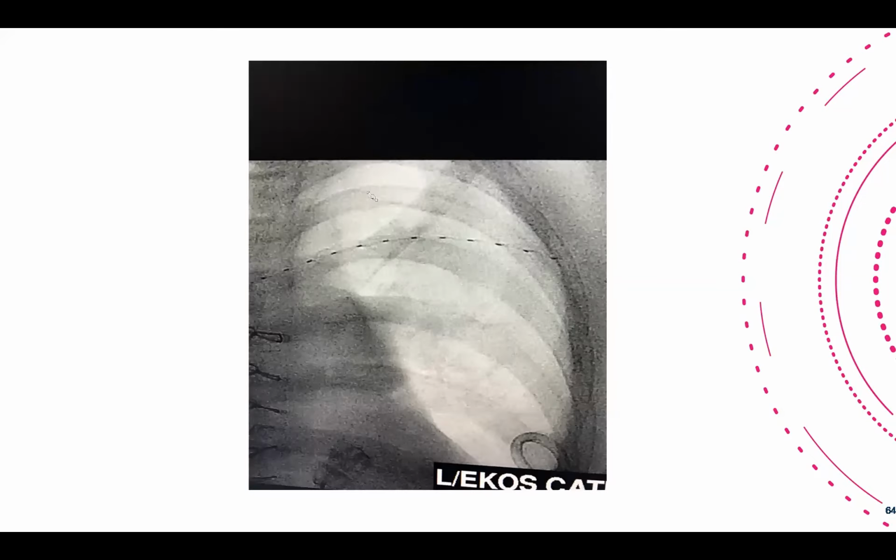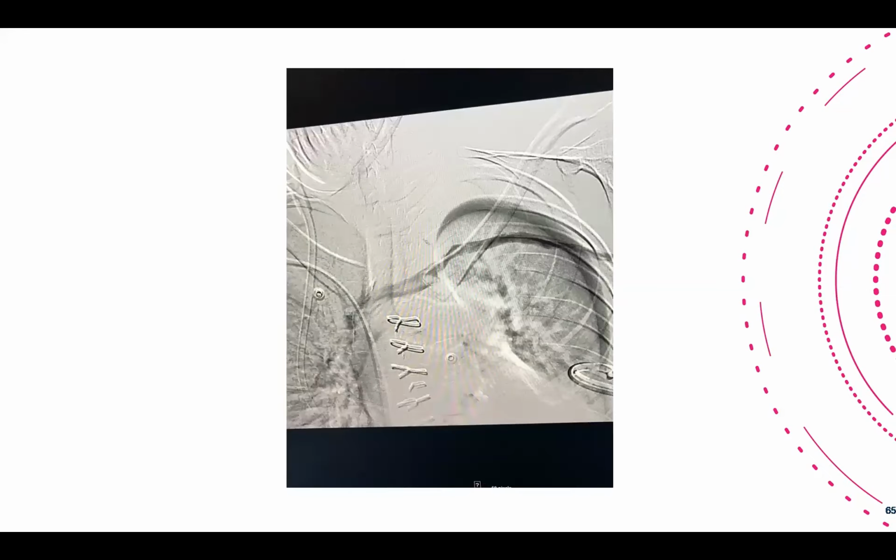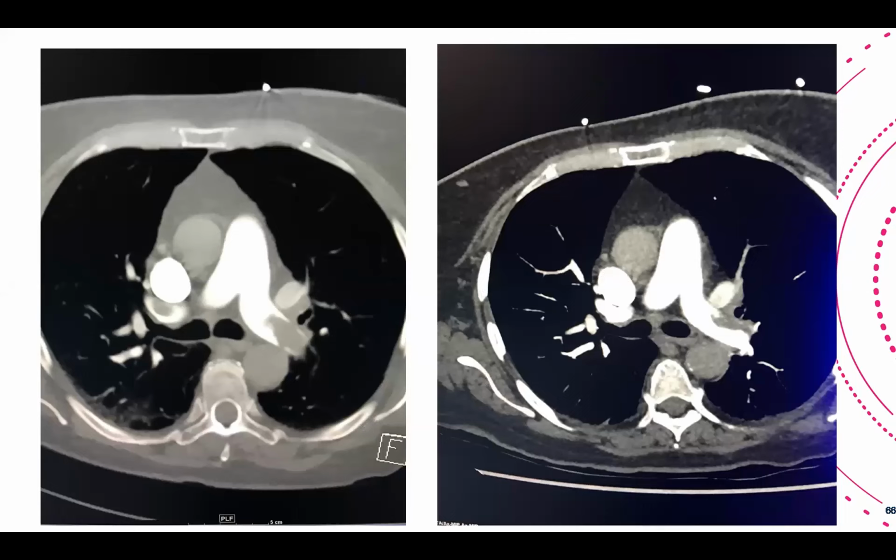I managed to get my wire through the clots, and then I left this special catheter inside the subclavian vein. And this is the result next day. There's good flow, and the patient was completely asymptomatic and was discharged from the hospital a few days later. This is another example of bilateral pulmonary embolism. You can see the filling defects on both sides, and this is the second day after the treatment. Almost complete resolution of the right side clot with some residual on the left side, which is not significant.